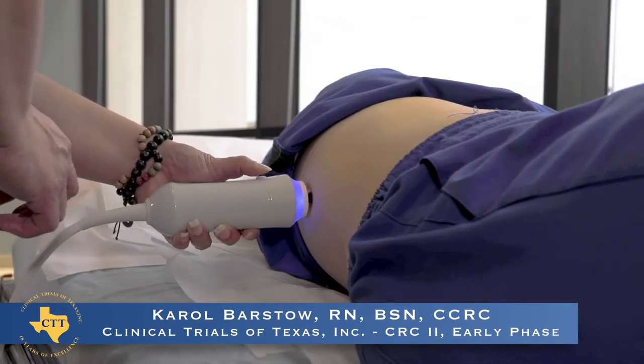These numbers we use not for diagnostic purposes, but just to give us an idea — and give you an idea — of how much fat or scarring you may have in your liver. We want these numbers to be low.